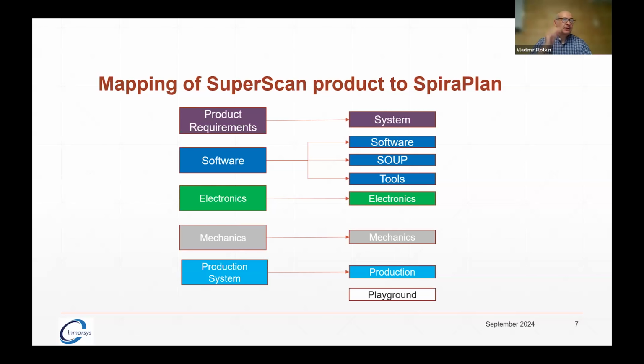Tools is very much the same. So you define what tools you're going to be using in the projects, and you create in your requirements what these tools are supposed to do, and then you do tools validation. It's very helpful when the tool comes pre-validated. So for example, you can buy certain compilers, which will come with functional safety validation certificates to IEC 62304 or to automotive 26262. So to the highest level, several compilers do this, you pay like 2-3 times more for the certified version, which is understood. So they need to do some additional work for it. But that's what it is.